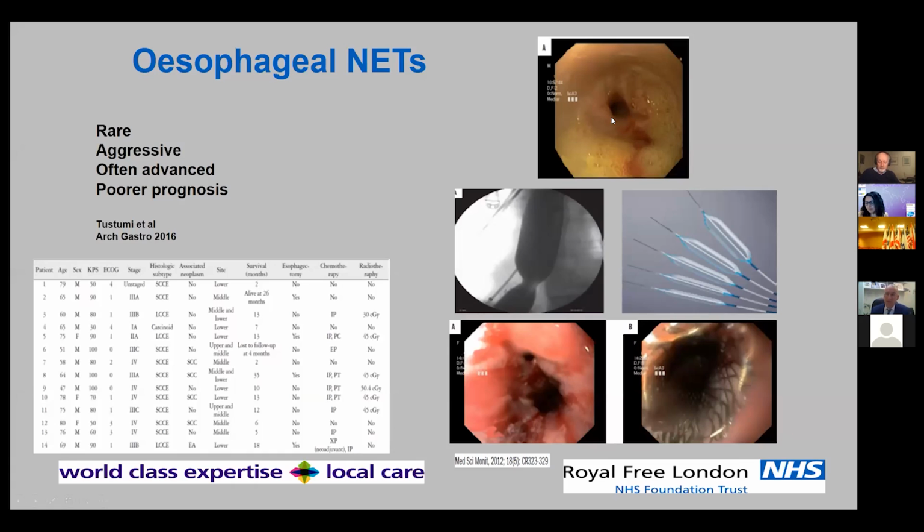This patient may present with difficulty swallowing, maybe vomiting. You can see below that we can dilate up strictures with balloons, and then you can see a radiograph of a balloon being inflated inside the esophagus to stretch it and open up the stricture.